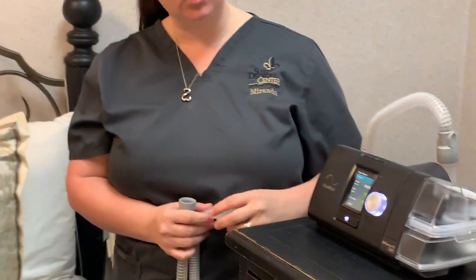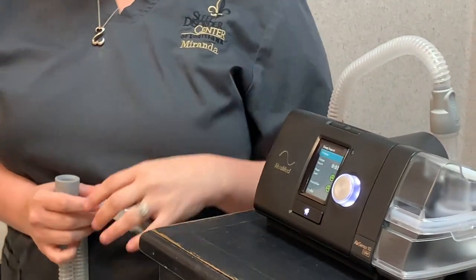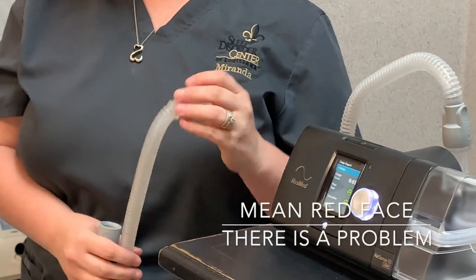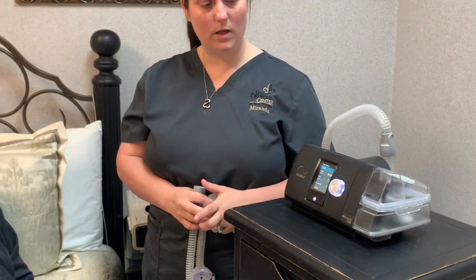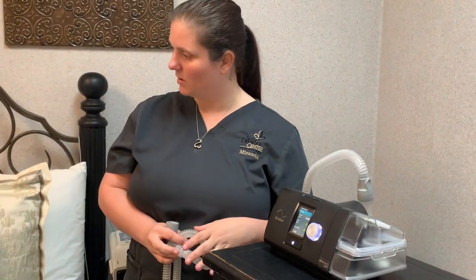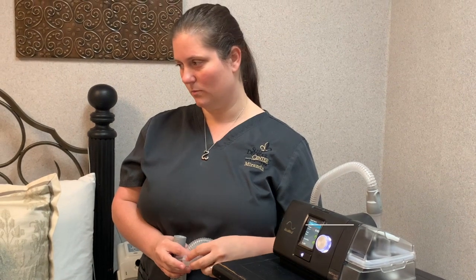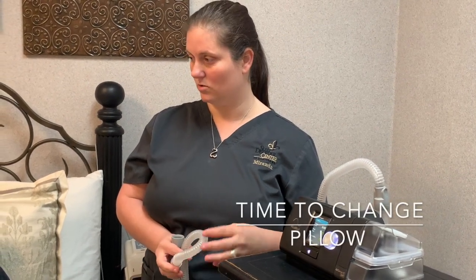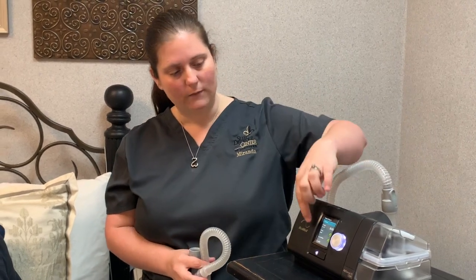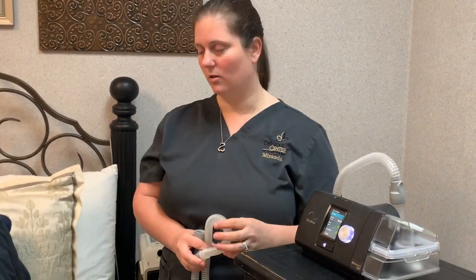It's also going to give you two green happy faces or two mean red faces for your mask seal. If you're getting a mean red face every night there's a problem — go ahead and call me and we'll get that fixed. If you use it for about six to twelve weeks and then you start to get the red face, it's probably time to change your pillow. That'll be the first thing I instruct you to do, and then it should go away.